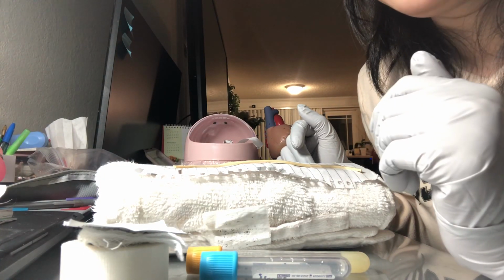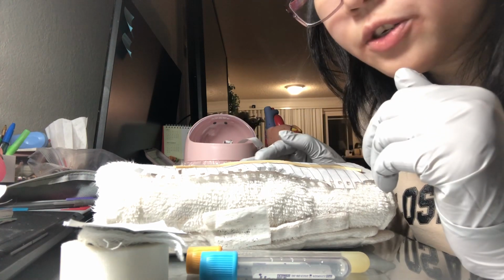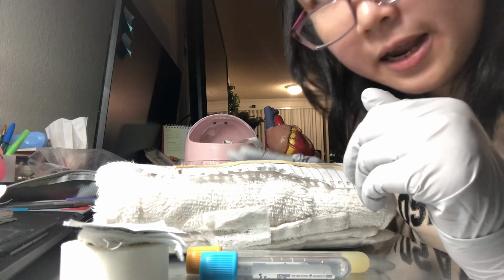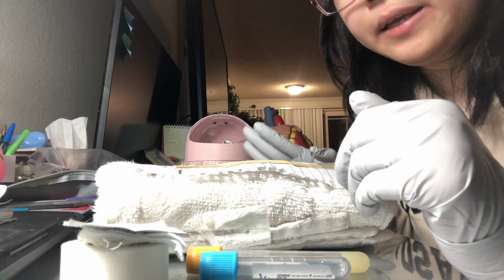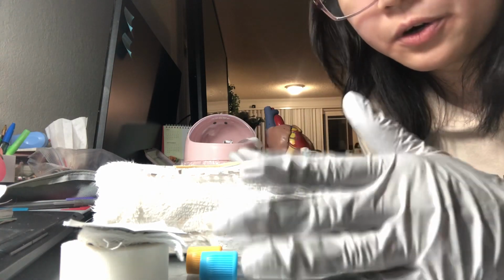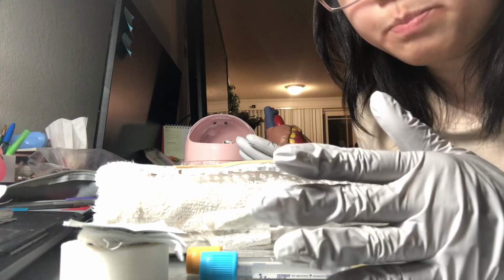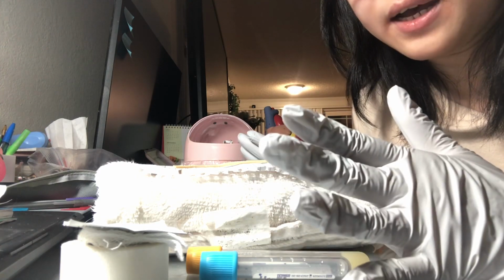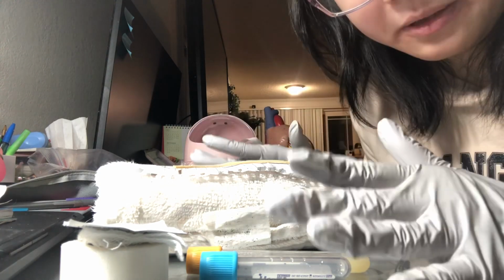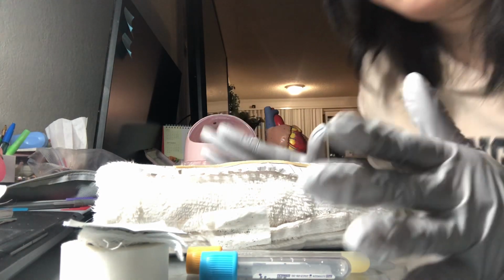Hello, I'm going to be your phlebotomist today. Can you spell me your first and last name? Can you tell me your date of birth? And the last one is, I want to ask her or him if he can provide any form of photo ID, so that I can confirm it with the information I have on the patient requisition.